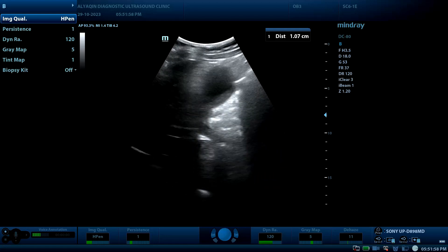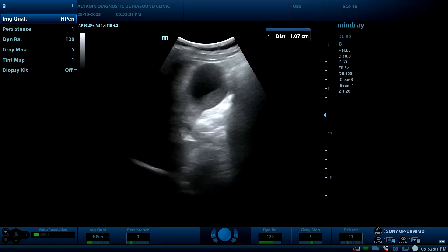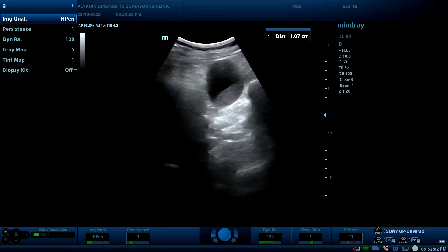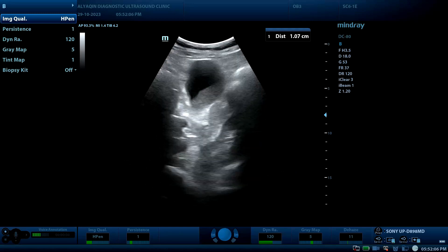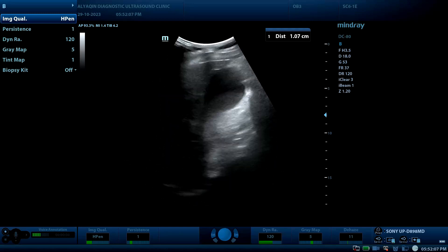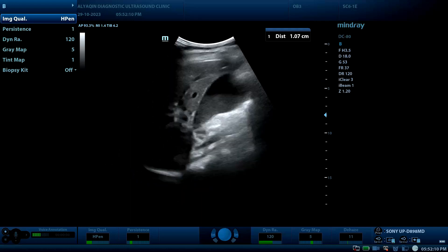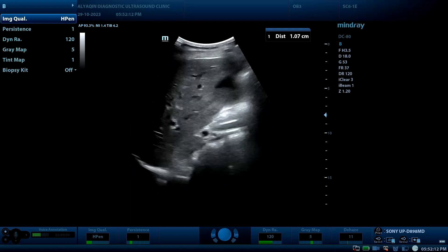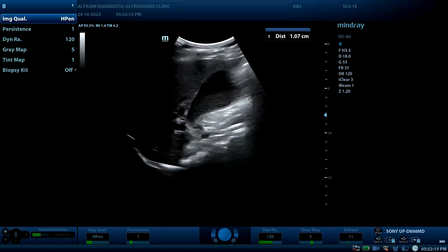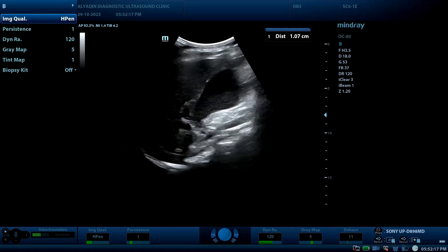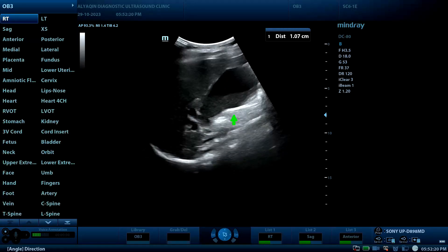17-year-old male with a history of yellowish discoloration of skin and sclera, dark urine for about 10 days. In the right hypochondrial region, we can see the gallbladder.